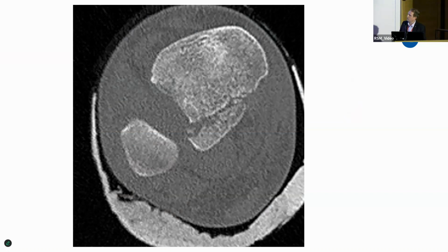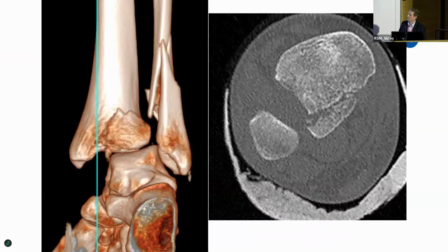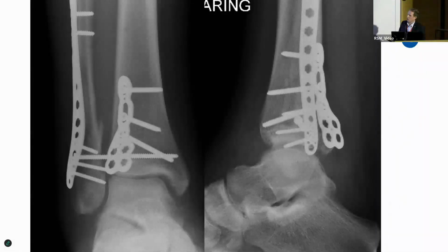So this is the case that this went wrong. So you can see a posterior malleolar fracture, quite straightforward, so through a direct lateral or MPM to get to that. My colleagues have gone through, they haven't fixed the distal aspect, treating it as not a rotational pilon, but an axial loaded pilon, which it's not. And then put this on the lateral side, and you can see we can start opening here and narrowing of this lateral column. And the reason for that is your short fibula.